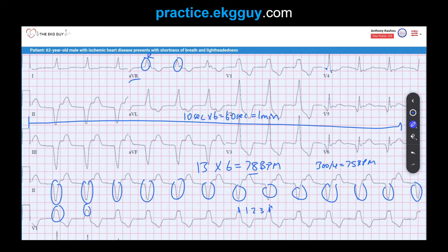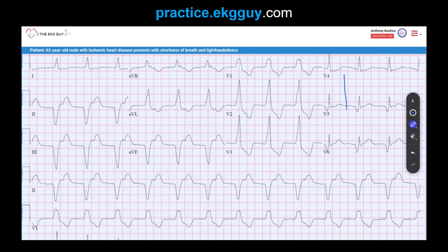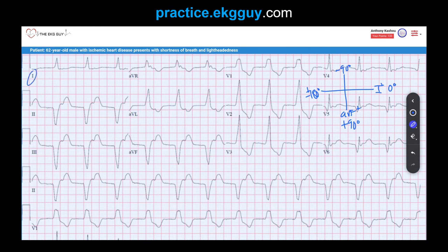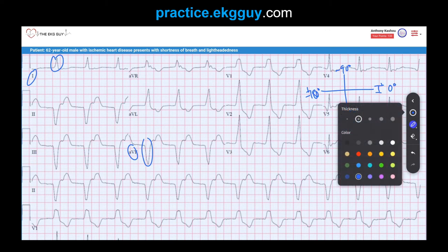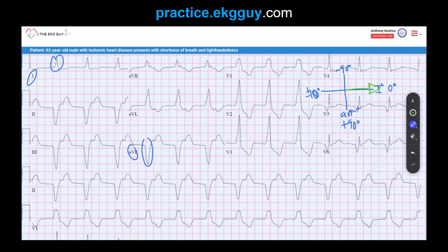This almost looks like a right bundle branch block pattern. If you factor that in with a left axis deviation in this case, that would favor more of a ventricular origin. To find the axis, imagine lead I and aVF with their positive ends: lead I is zero degrees, aVF is positive 90 degrees. Lead I here is positive, and lead aVF is negative, so we're heading toward lead I and away from aVF, putting us in the upper left region.